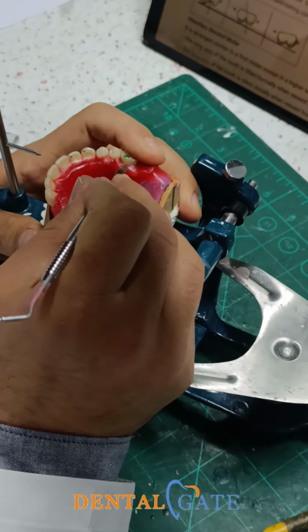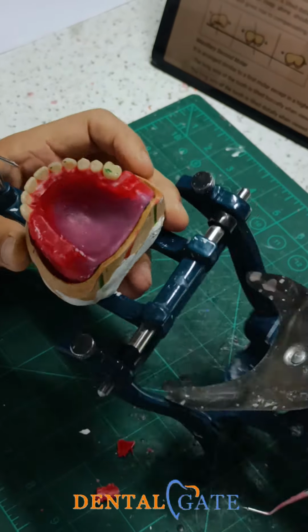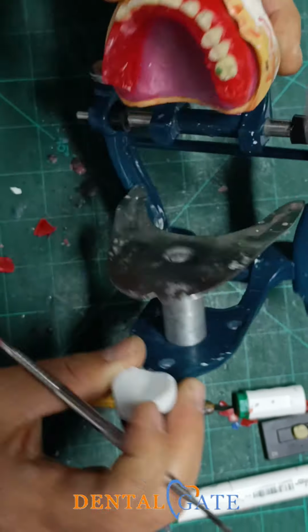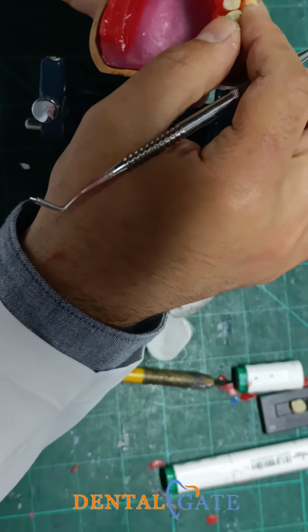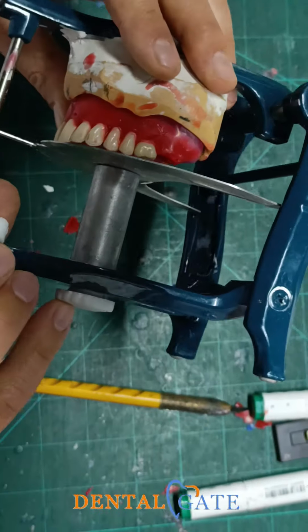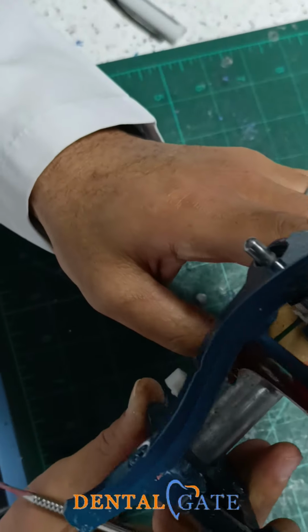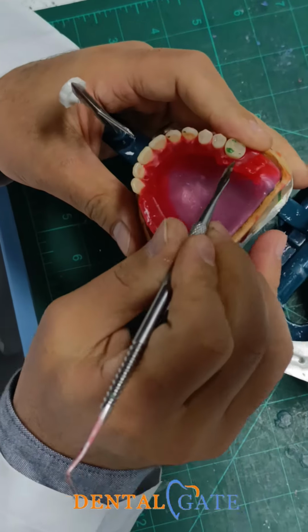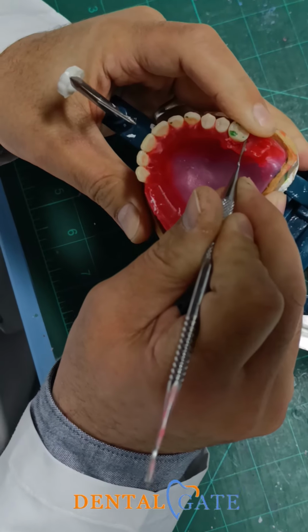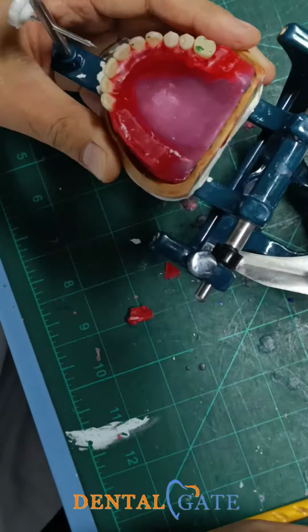You can see I will raise this cusp toward the table. Make a check. You can see only this cusp touches the table. Only this cusp should touch the table. Make evaluation from the posterior aspect. To be sure, only the functional cusp touches the table and the other tilting should be performed now.